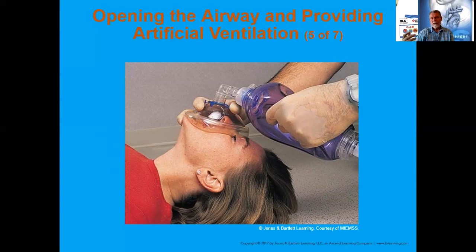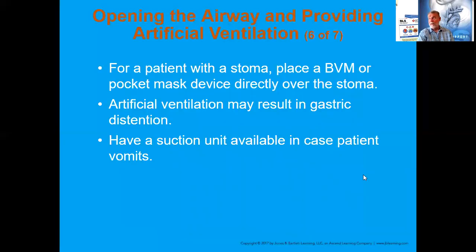So it's probably the hardest with an adult, depending on the size of your hands, but can we use a partner to simply hold the mask while one squeezes the bag? Sure, that's great, provided we're not doing compressions at that time, unless you have a third rescuer with you. So a lot of different options for this, but practicing with a bag valve mask is something that definitely takes you a little while to get accustomed to.